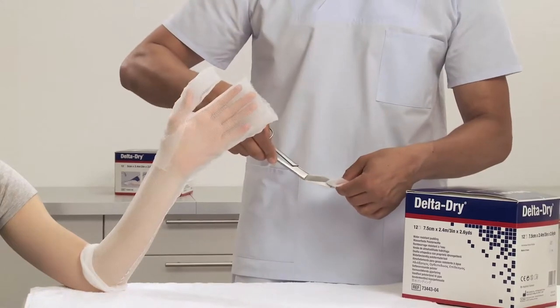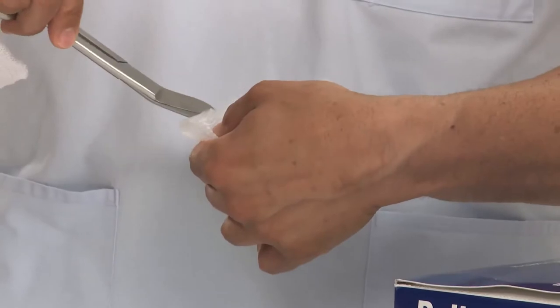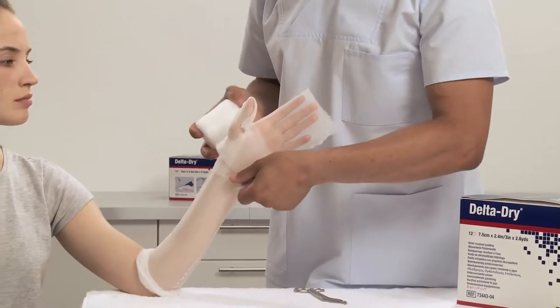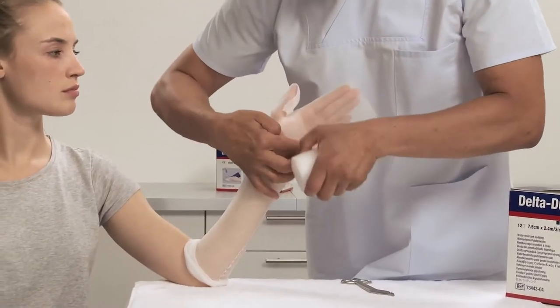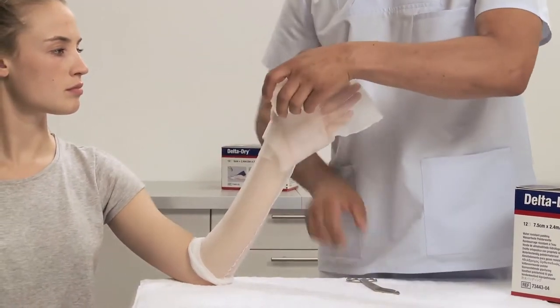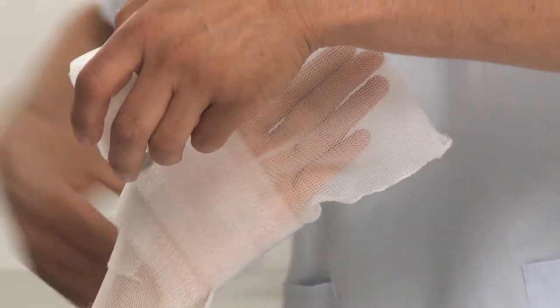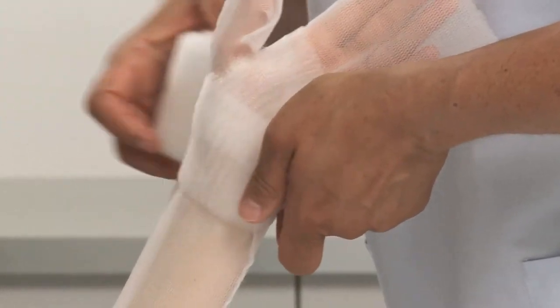Cut a small cross in the padding and put the thumb through the cross, fixating the padding for easier application. Apply the padding by going through the web space once and work proximally with a 50% overlap. This technique creates two layers of padding and should be sufficient in most cases.